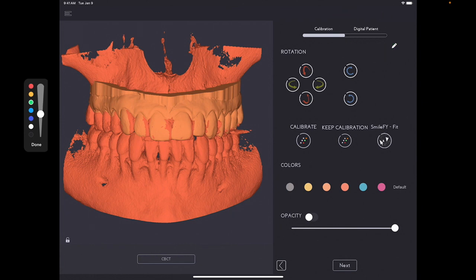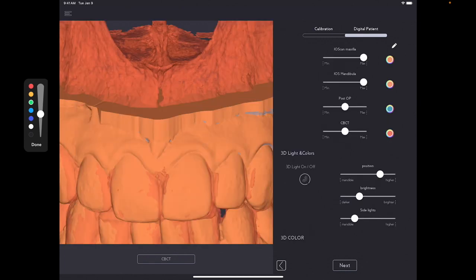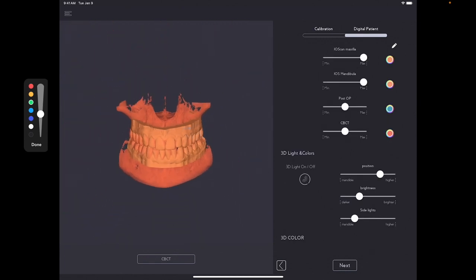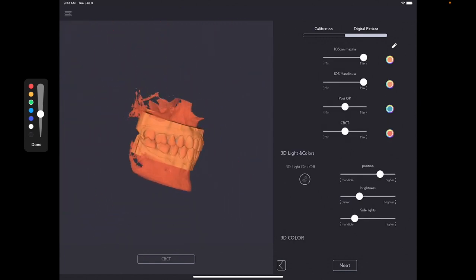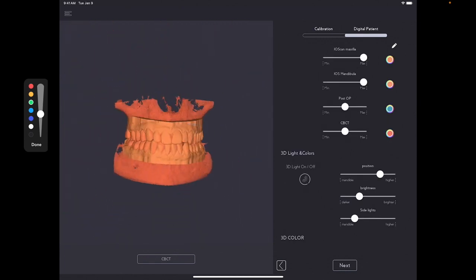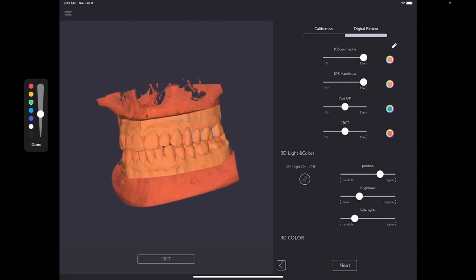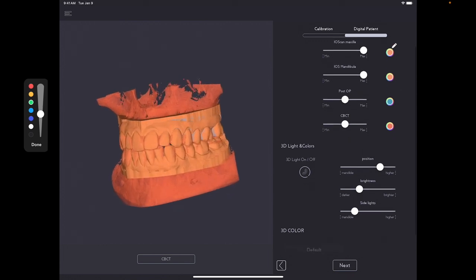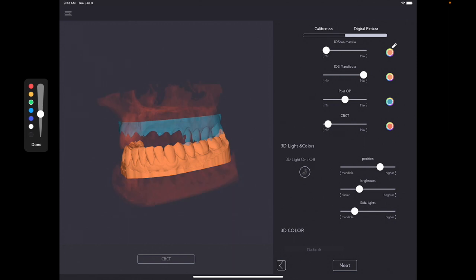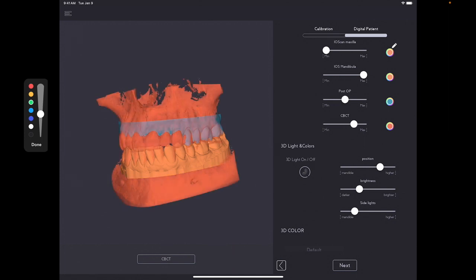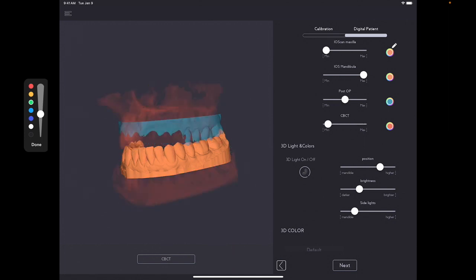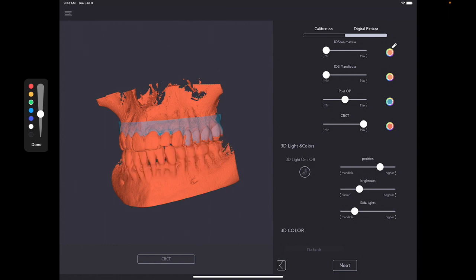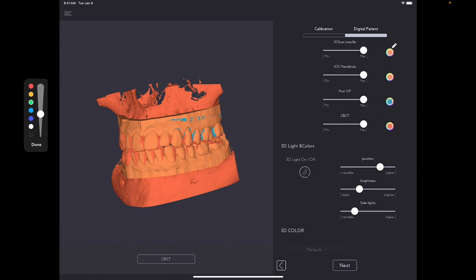And then if you want to visualize the whole patient calibration, you simply go to digital patient. And with the digital patient, you will be able to see everything from the original file, the CT scan with or without it. You can just change opacity over here. Here, you can remove the mandible.